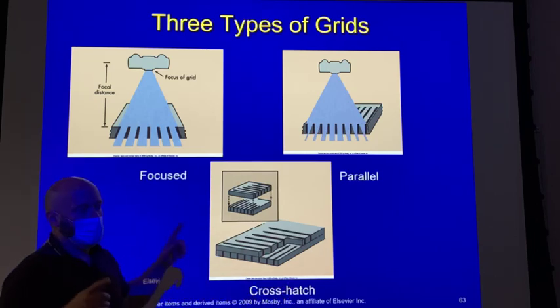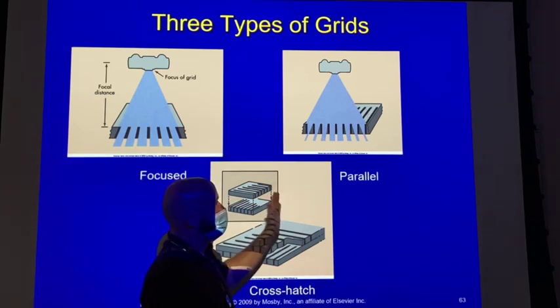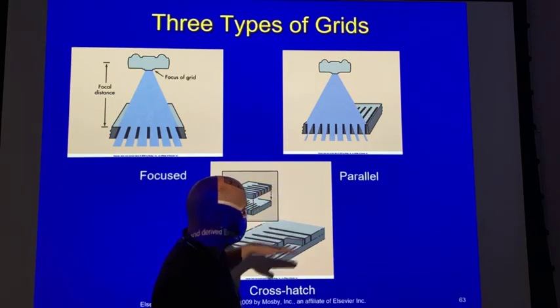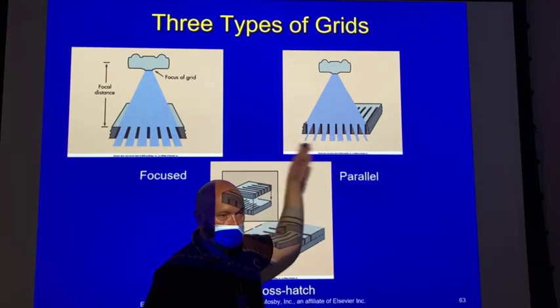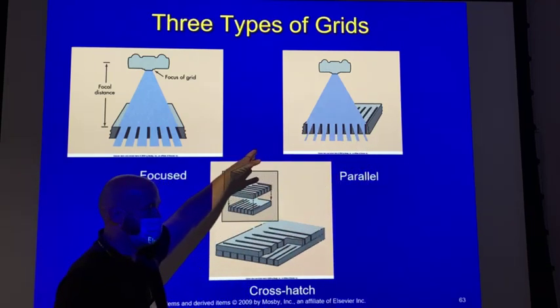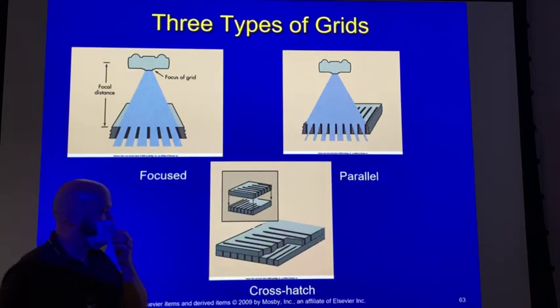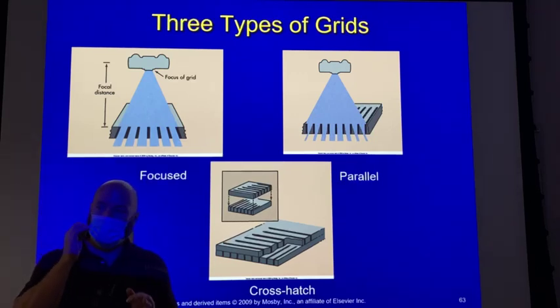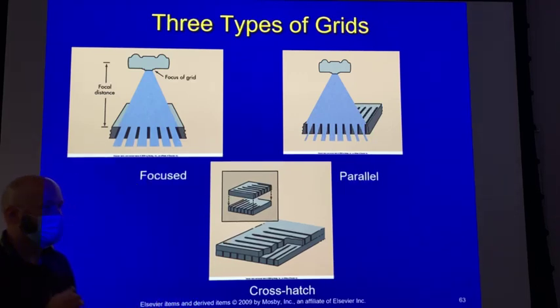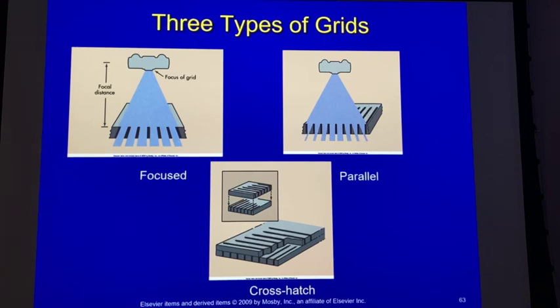With just a crosshatch where there are two parallel grids stacked on top of each other, you can still go off-center somewhat, right? You can still put the patient almost anywhere on the grid that you want the patient to be. But with a focused crosshatch, your central ray has to be pinpoint to the dead square center of the grid, otherwise you're going to have grid cutoff outside of just that point.